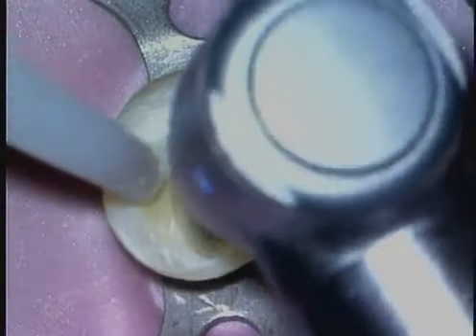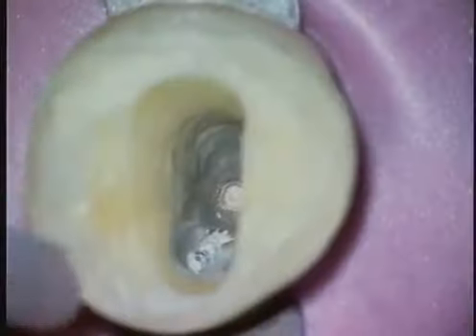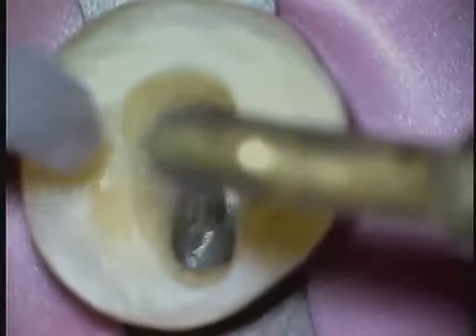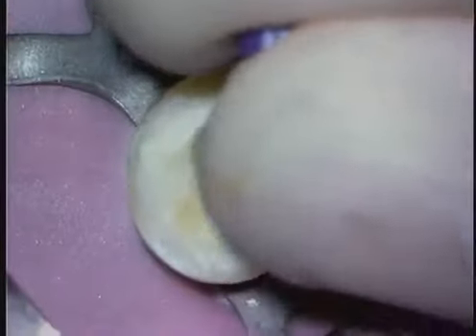We've talked several times during this tape about the importance of facing off orifices with Gates Gliddens. This is a really important secret because a lot of times once we fill these chambers with, like, a chelator, our visibility is now obstructed. So now we can slide instruments down smooth axial walls into these faced-off orifices, and it helps negotiate the canals. Ultrasonics can chase out the isthmus or related anastomosing between orifices, and again with a faced-off orifice we can pretty easily slide into this system.